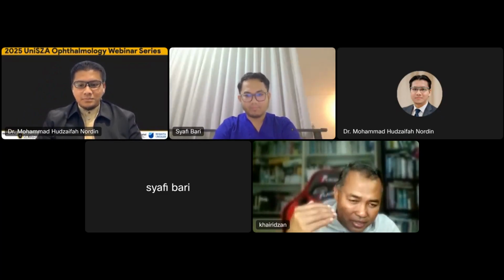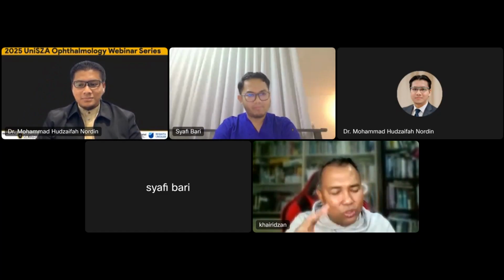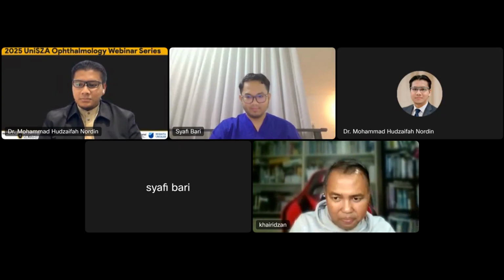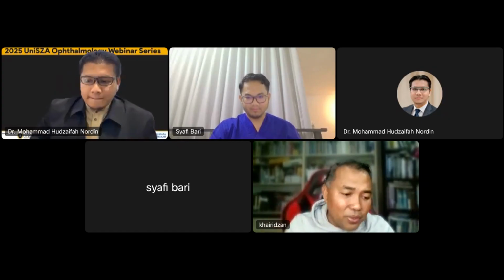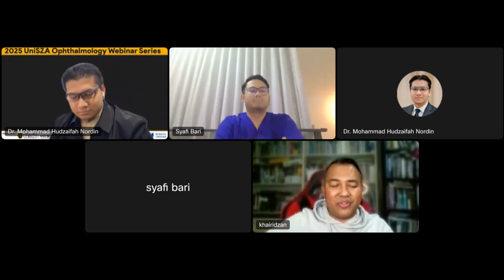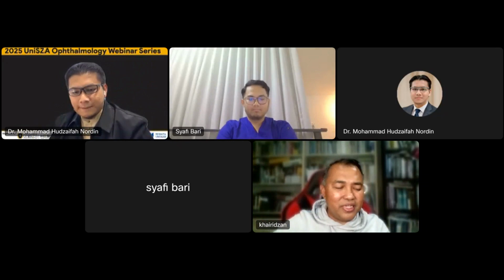There are two important things that you want to know. First, like Dr. Hudzaifah said, whether you are looking at the functional vision of the patient. The other one is that you really want to know the IOL performance. These are two different things, so when you are given a new lens, these are two different things.